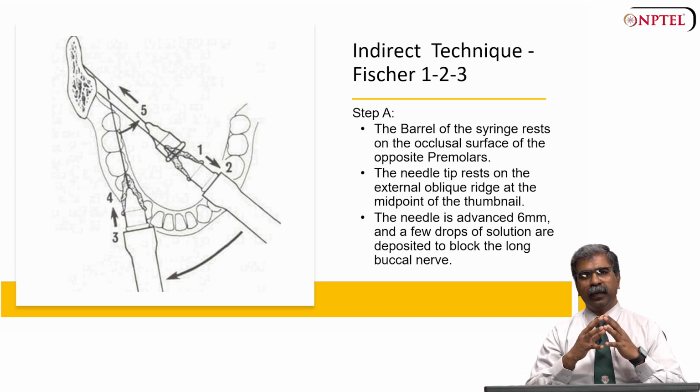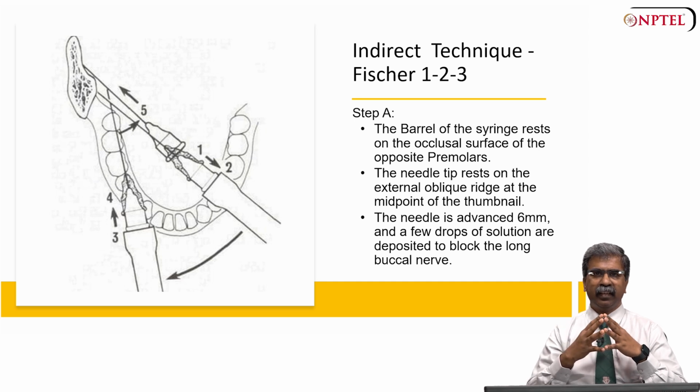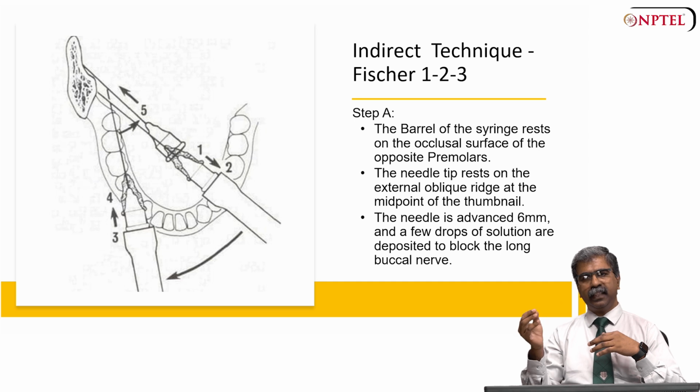Now, we'll go on to another technique, which is an indirect technique, the Fischer 1-2-3 technique. There are 3 steps involved in this: step A, step B, and step C.